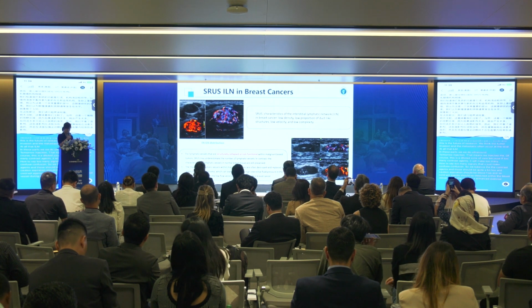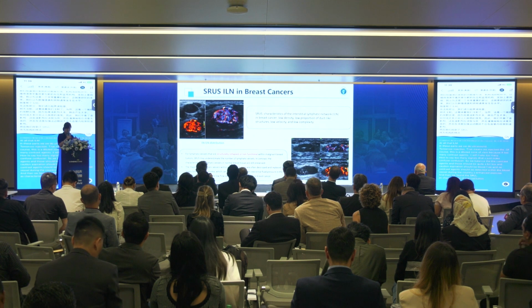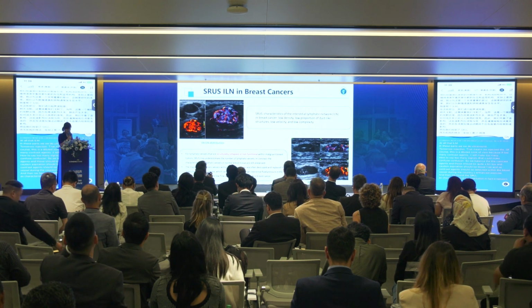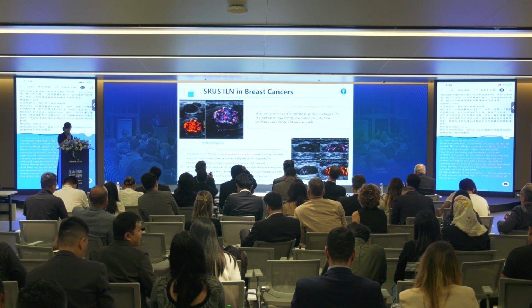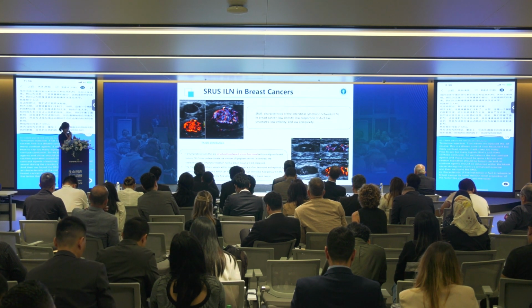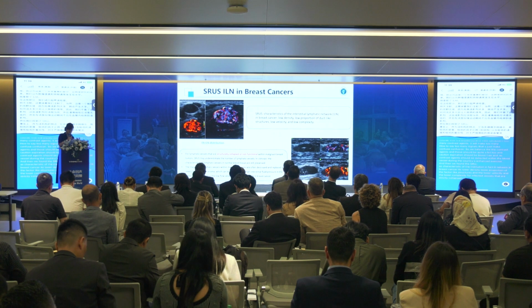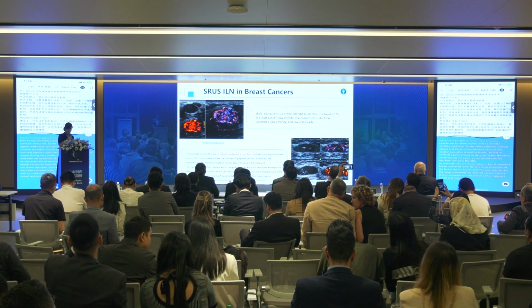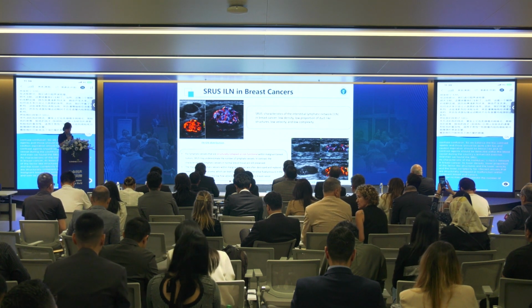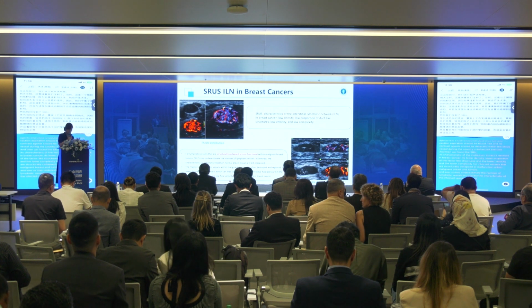And then we found the SRUS characteristics of the interstitial lymphatic network in breast cancer. It has lower density, lower proportion of duct-like structures, lower velocity and lower complexity. For lymphatic vessels that are structurally collapsed or non-functional within malignant breast tumors, SRUS may underestimate the number of lymphatic vessels. In contrast, the characteristics of lymphatic vessels in normal breast tissue are still preserved.